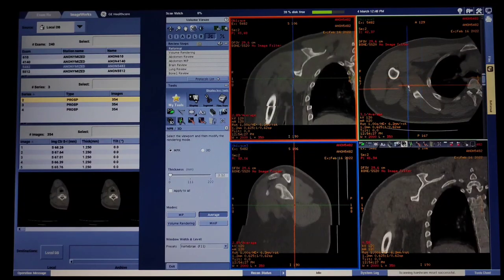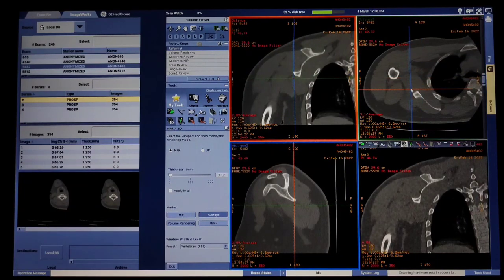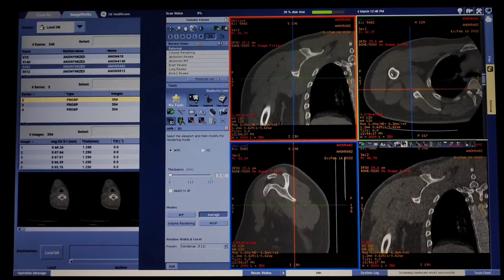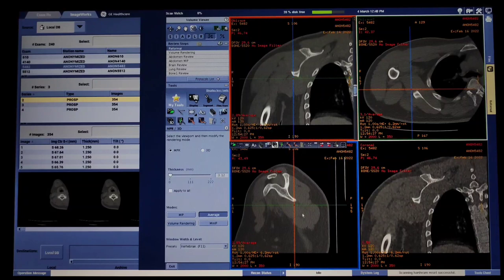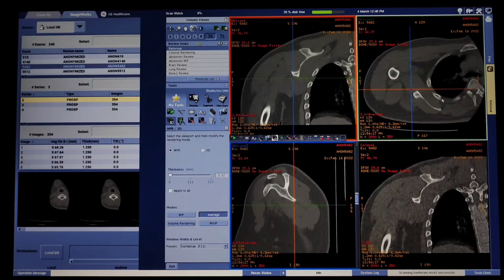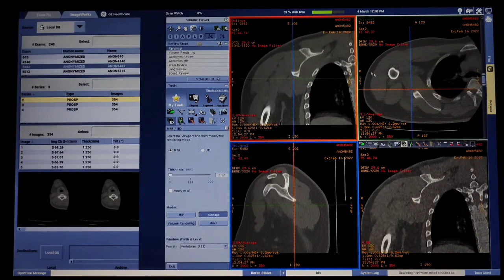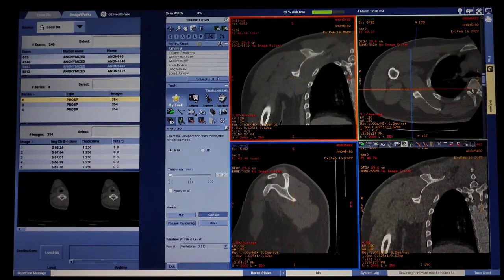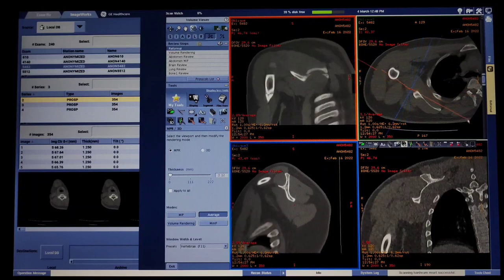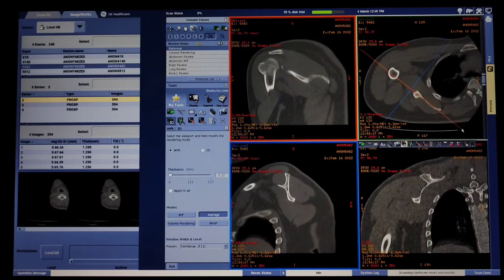Then we have to select multi-obliques. What will happen? We have to select three planes: axial, coronal, sagittal. Then we have to select symmetrical. Then we have to select humerus and scapula, which must be chosen in orange.